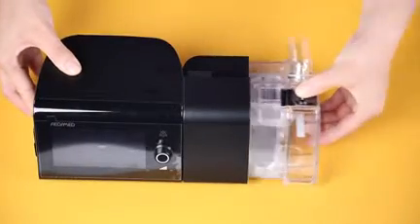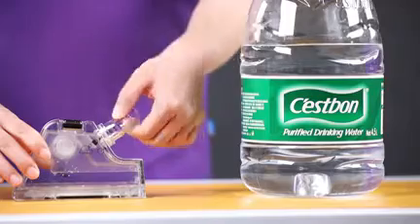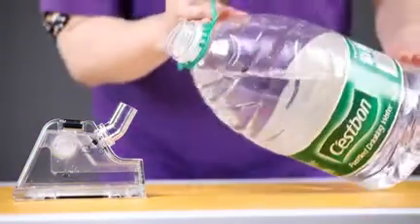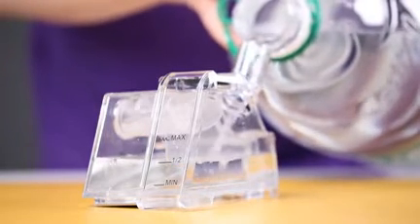Hold the press button to release the water tank. Fill in the water through the inlet to the maximum level. Make sure to only use distilled water or purified water for your own health.